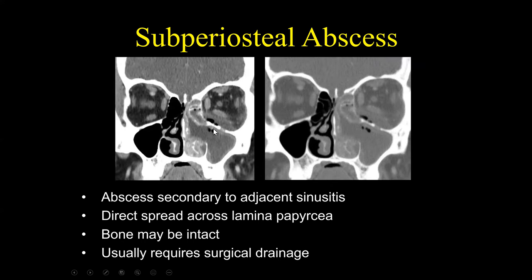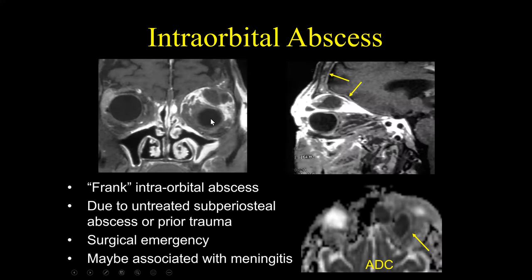This was a subperiosteal abscess arising from acute sinusitis of the maxillary sinus — a large subperiosteal abscess involving the floor of the left orbit, with air associated. If this continues to progress, it can develop into a frank intraorbital abscess — the fourth stage of the Chandler classification. We can almost see the three-globe sign: a globe on the right, a globe on the left, and a fluid collection in the superior orbit. An intraorbital abscess is due to untreated subperiosteal abscess or prior trauma and is a surgical emergency. ADC mapping shows decreased signal confirming the abscess, and sagittal T1 images show diffuse enhancement involving the meninges — this is an intraorbital abscess associated with meningitis.